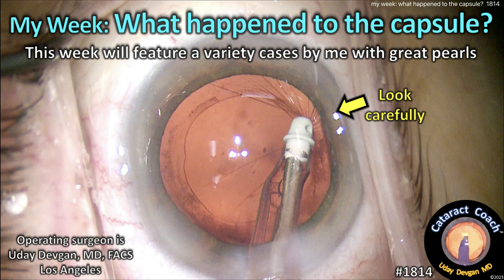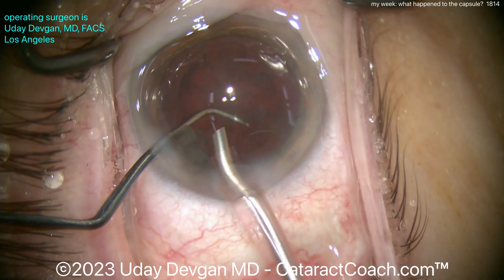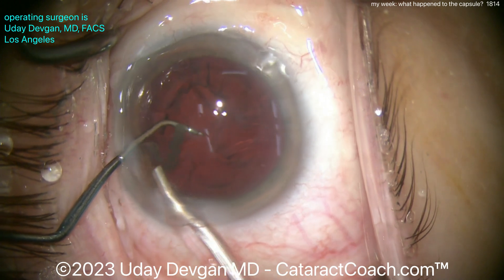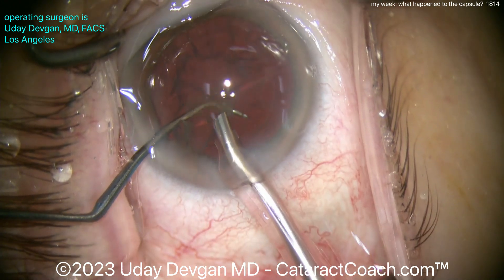cataractcoach.com — 'What Happened to the Capsule This Week' features a variety of cases by me as the operating surgeon. Let's watch this case. There's the nucleus being moved — up to this point a totally normal case, normal rhexis, normal everything, normal nucleus removal. I know you want to see the good stuff.